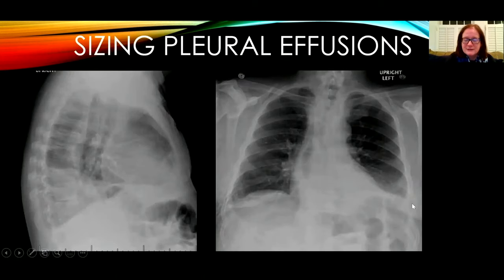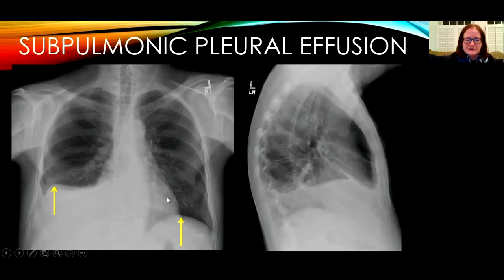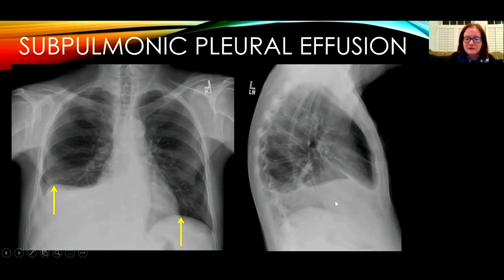When sizing pleural effusions, this patient has a small left pleural effusion on the frontal view, but on the lateral view there is quite a sizeable effusion. It's possible to hide 250 to 300 mL in the costophrenic recess before it becomes visible on the frontal view. This patient has a subpulmonic pleural effusion with fluid underneath the right lung. This can simulate an elevated hemidiaphragm, but the dome of the apparent hemidiaphragm is displaced more laterally, with a gradual medial slope and a sharper lateral slope. The subpulmonic pleural effusion can also be seen on the lateral view below the lung.